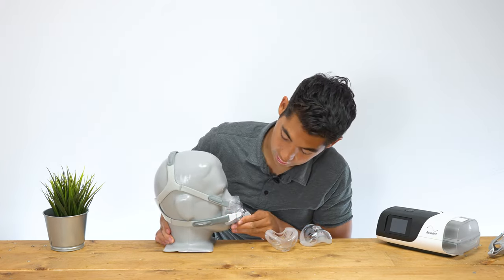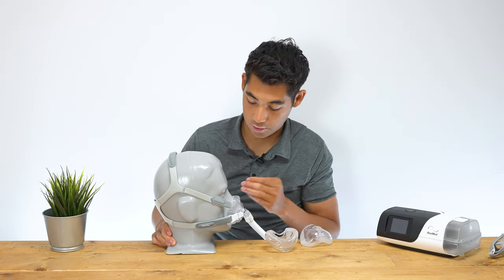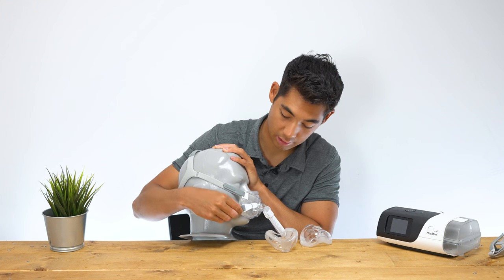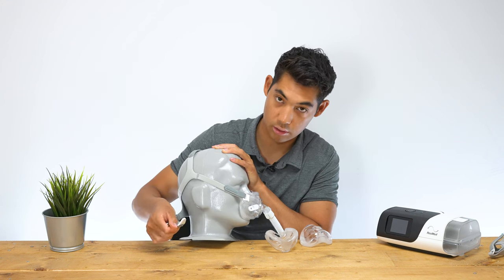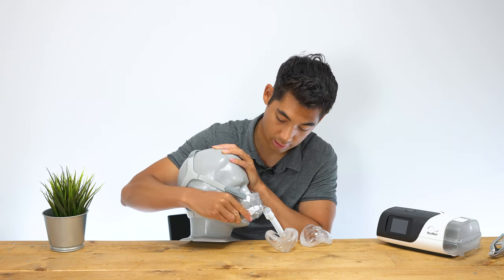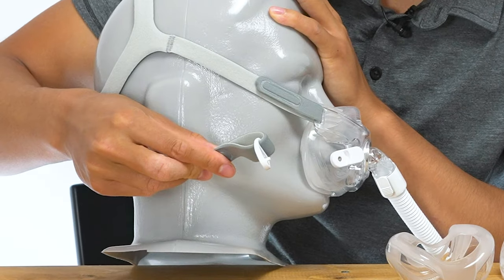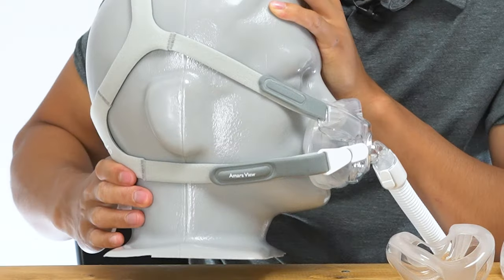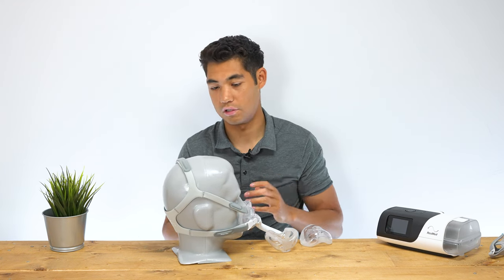Going around the front, we see adjustment straps up here as well. And right here we have the magnetic clips — it just snaps on like that, really easily. You might be looking at this and thinking, wow, the magnet snaps on so easily, it must be a strong magnet — and you'd be correct. It is a very strong magnet.